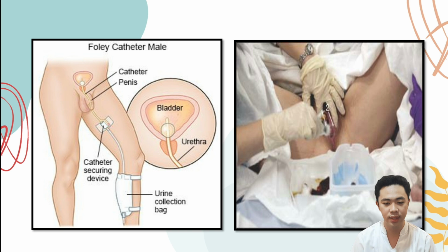For an indwelling catheter, secure the catheter tubing to the thigh for female clients or the upper thigh or the lower abdomen for male clients with enough slack to allow usual movement. Wipe any remaining antiseptic or lubricant from the perineal area. Replace the foreskin if retracted earlier. Return the client to a comfortable position and instruct the client on positioning and moving with the catheter in place. Discard all used supplies in the appropriate receptacle. Remove and discard gloves. Perform hand hygiene.